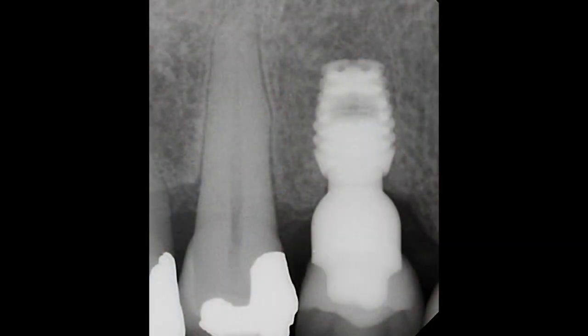Hopefully this video has shown you the simplicity of how to use a sulcus reamer to achieve the definitive seating of an abutment, integrated abutment crown, or extra-orally cemented crowns.